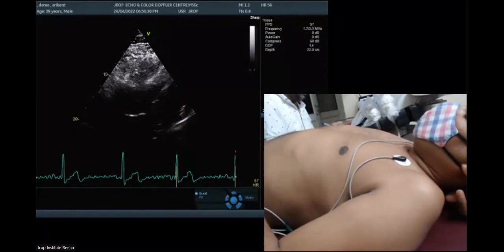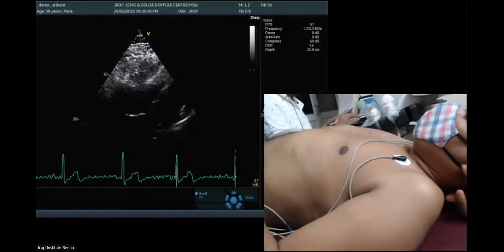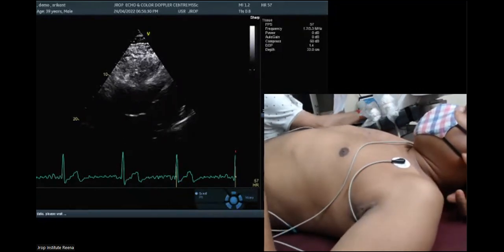Yes, sir. Go ahead. Sir, how do we calculate LA volumes? Are the LA volumes reliable in two-dimensional echocardiography? And my second question is, sir, how to effectively see the pulmonary venous drainage? Let me just go to two images together first.